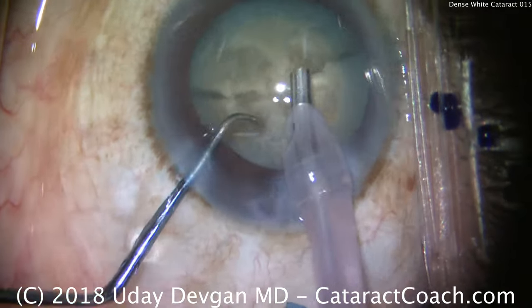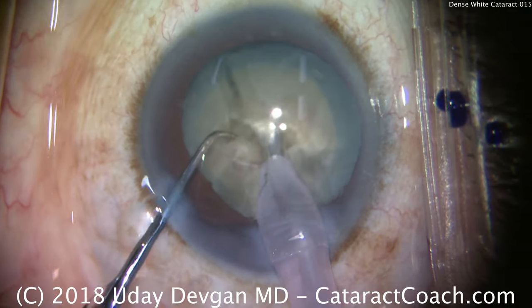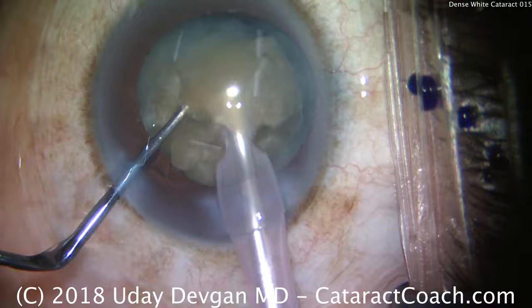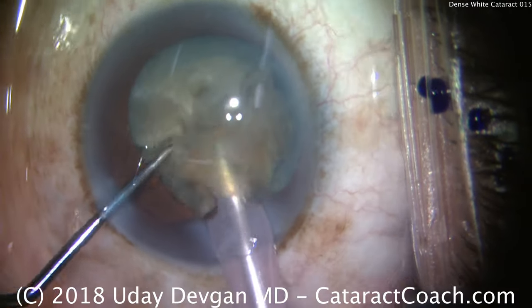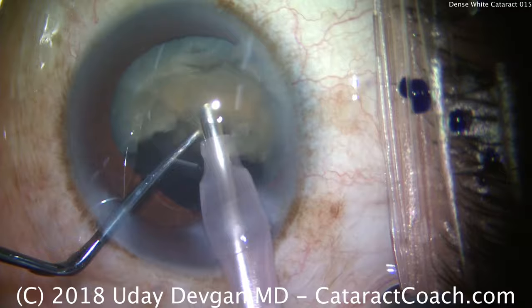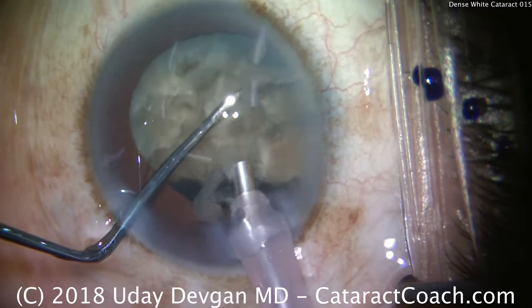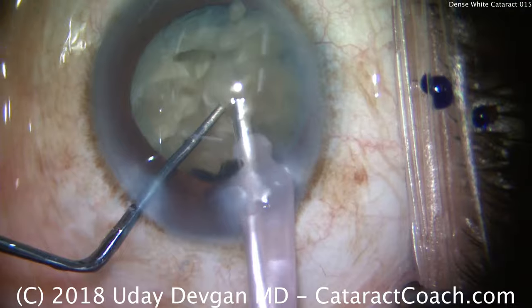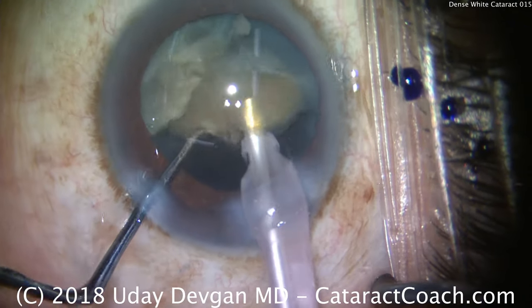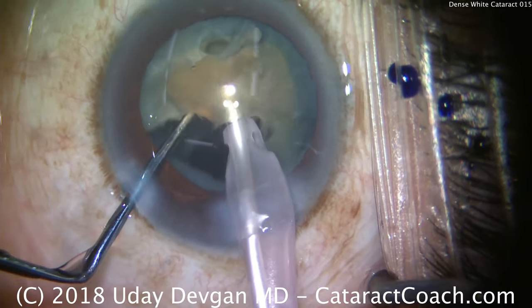So into the little quadrant here as well — try to bring it up, it's a little bit attached still. So let's try to separate these pieces more, let's rotate the nucleus. There's a big piece — let's see if we can get this one out. You see down there, deep in that crack, it's kind of attached. That helped separate it. So now we're taking our time. We use phaco power modulations to minimize the energy in the eye. We recoded the endothelium with dispersive viscoelastic, and we're also operating lower at the iris plane — we don't want to ride the corneal endothelium.